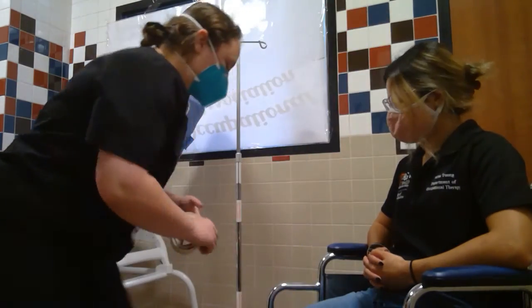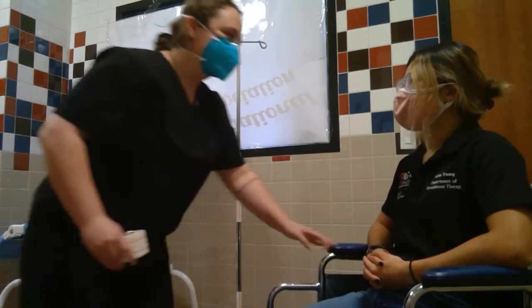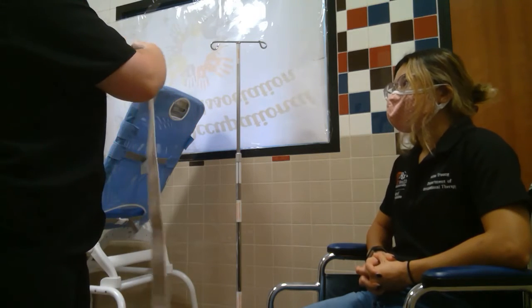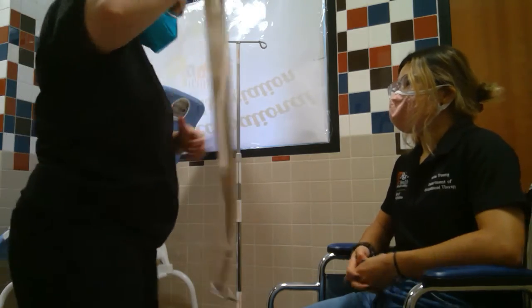Okay, Rachel, so what we're going to do now is I'm going to have you get out of the wheelchair for a little bit and stand up. Are you alright with that? Okay. Yeah, I know you're a little scared of it, but we want to help you be able to stand and stuff, so I want you to get that confidence. Okay. So I'm going to put this around you first though so that you can be safe.